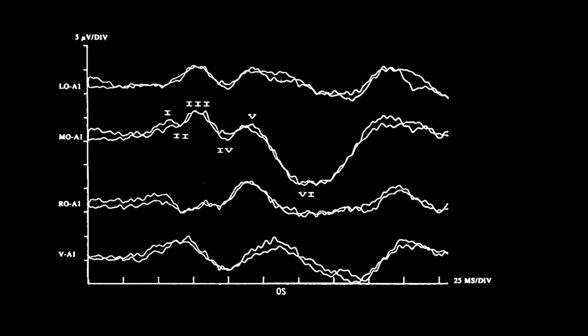It was obtained using goggles and stimulating the left eye. The analysis time was 250 milliseconds. The preferred montage is highlighted. The left ear was used as a reference for all channels. An alternative montage is to use linked ears as a reference or the vertex as a reference for all occipital derivations.